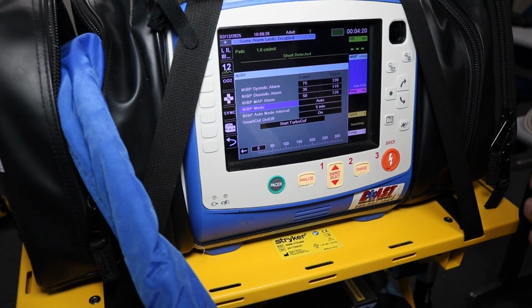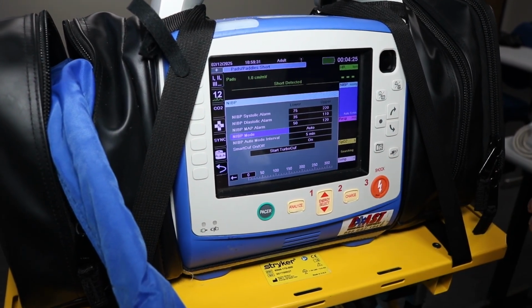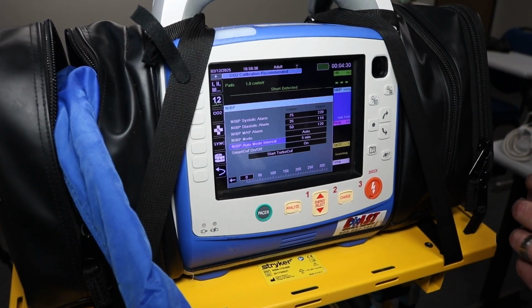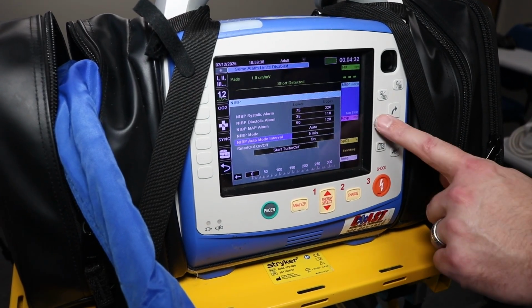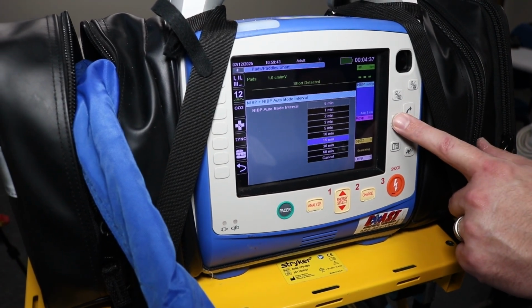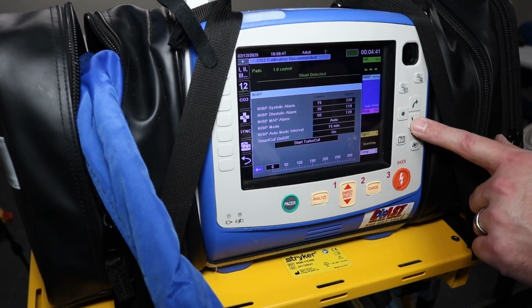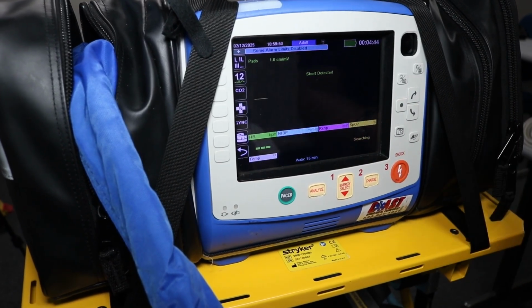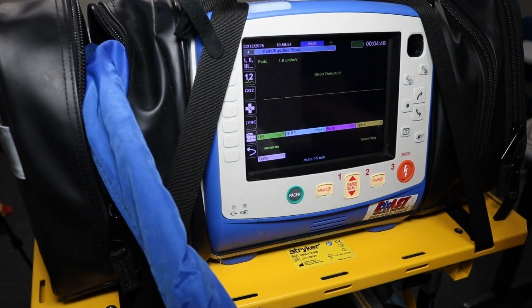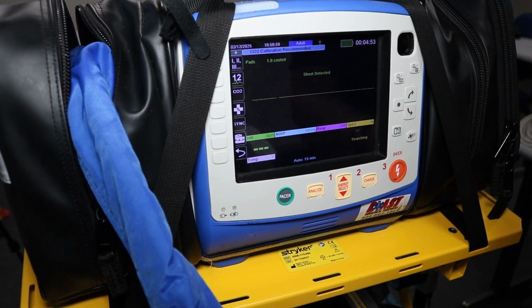Now we need to adjust our blood pressure interval. Right now it defaults to 5 minutes, but we want to set it to 15. So we're going to go down to there, select, and move the button down to 15 minutes. Select again, and you can scroll all the way back to the back button and hit select, or you can hit the home button. You know you have configured it and set it up correctly. At the bottom, it should say auto 15.